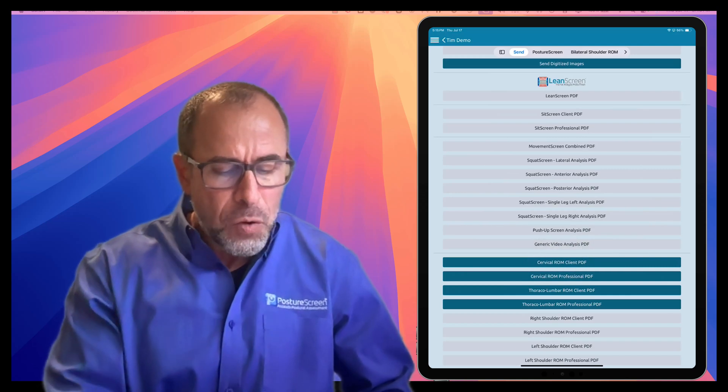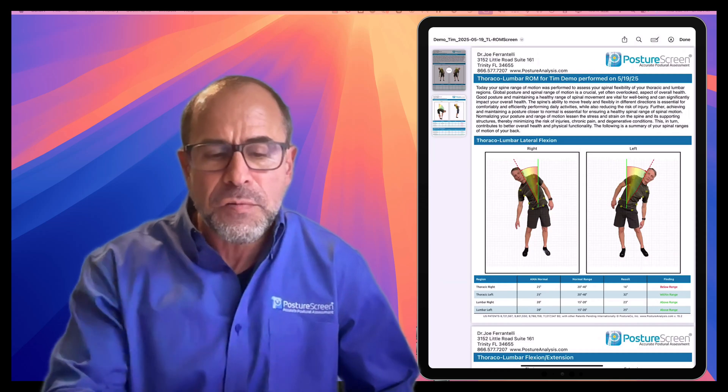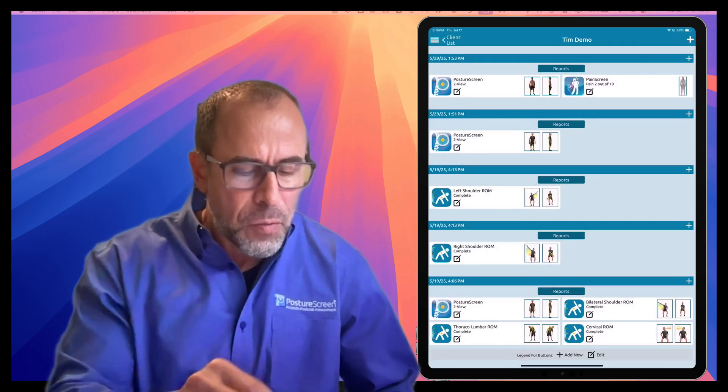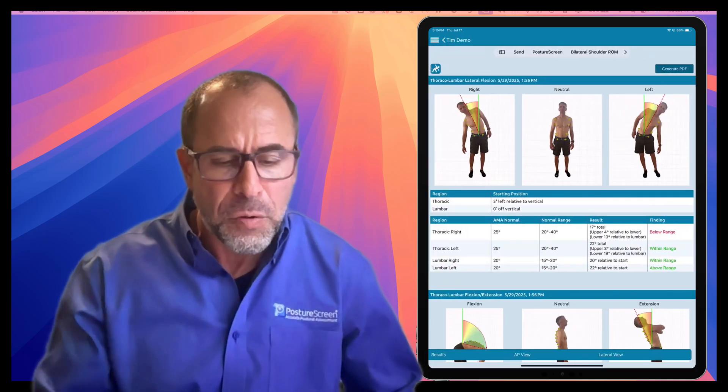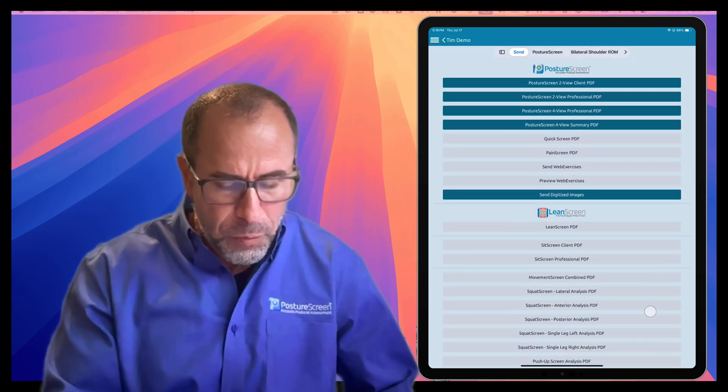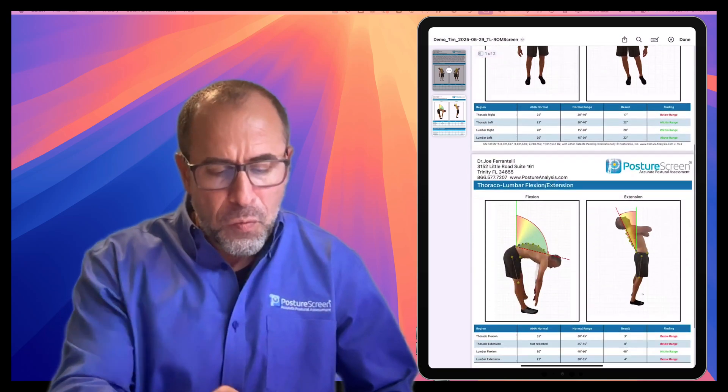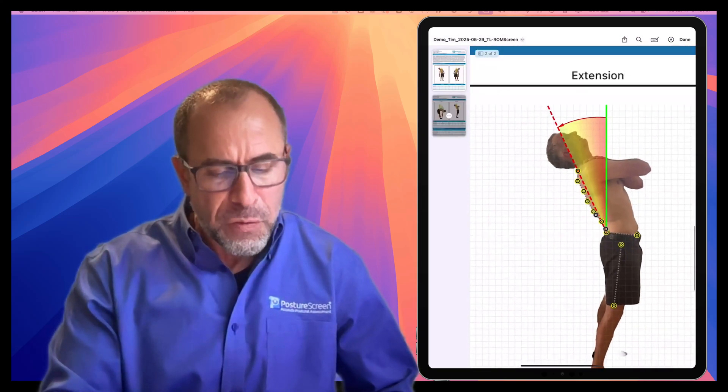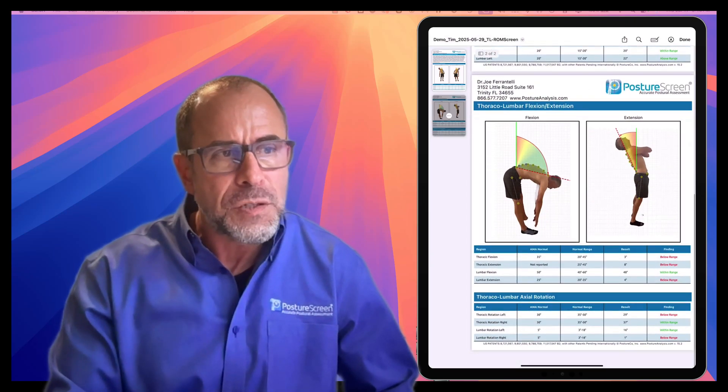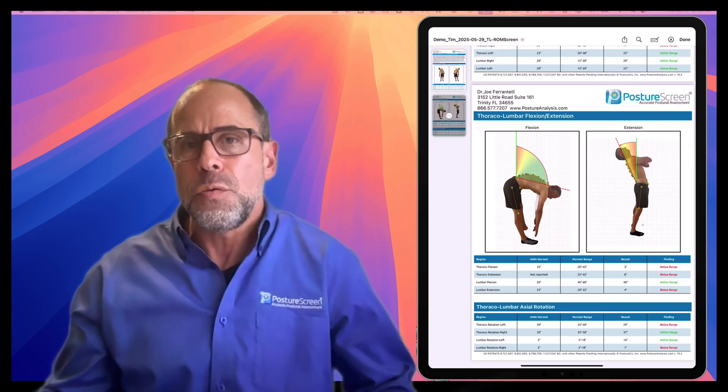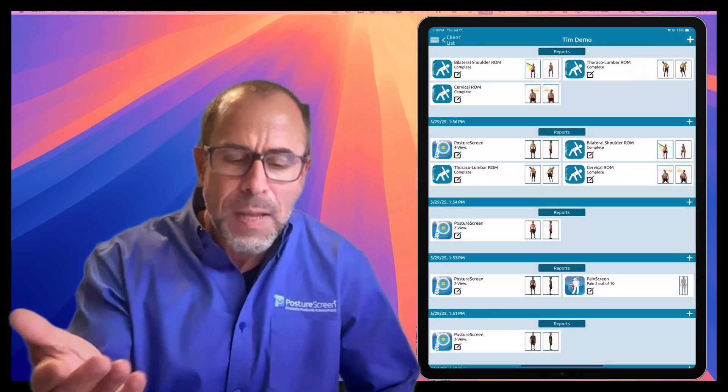Now, what's unique is with the thoracolumbar spine, we're able to track their posture as well. If I generate a report for thoracolumbar spine for the patient, notice what we're able to do is we're literally tracking the curvature of their back from start position to flexion and extension, and then reporting back to normal ranges. How cool is that? And of course we can do follow-up exams and comparisons.